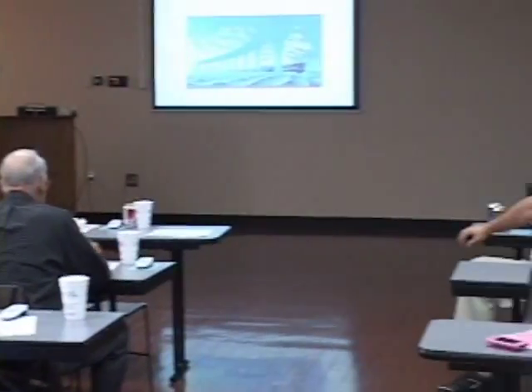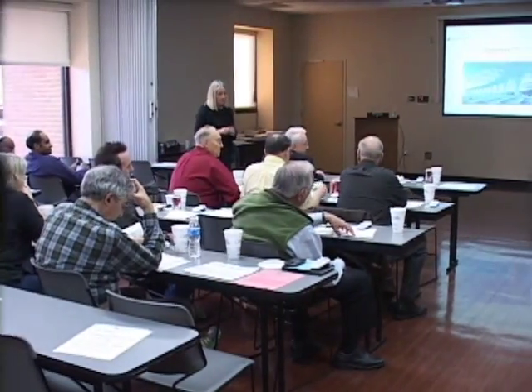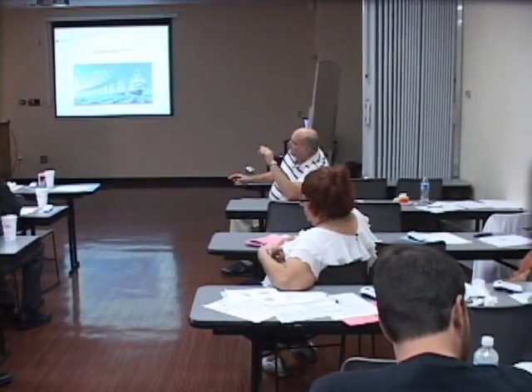Good, but the problem is they have their consistency, so they'd always be reaching across the patient. Or walking across. And the only way would be to flip it, and there's a way to flip it, but you have to find an electronic device that, if you flip it, the picture's now upside down and around. Right. And you can buy an electronic box for about $1,000 that electronically will turn it back the other way.